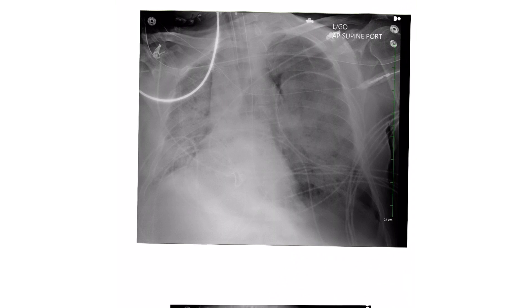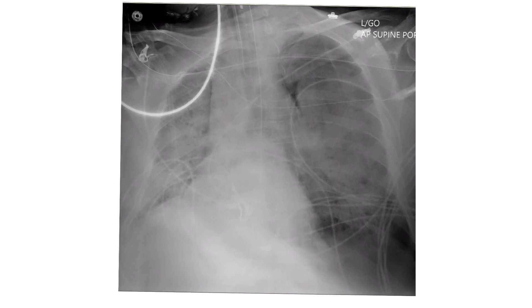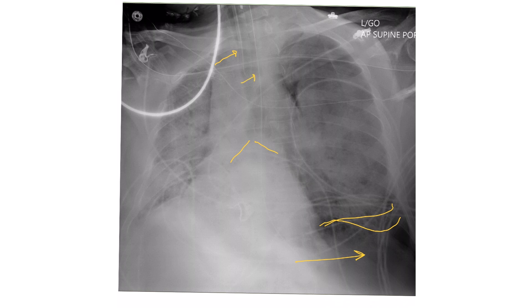This is a chest x-ray for a patient we had. I want to show you — there is a large pneumothorax in this area with lung compression. This is the ET tube, this is the tip, and the carina is right here — good position. This is the NG tube going all the way down, also in good position.